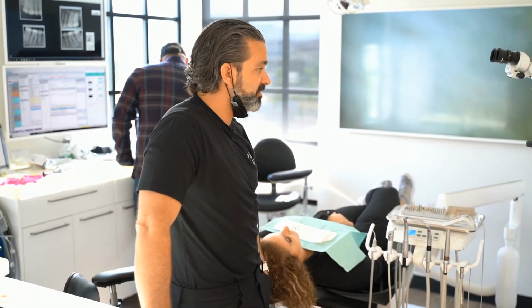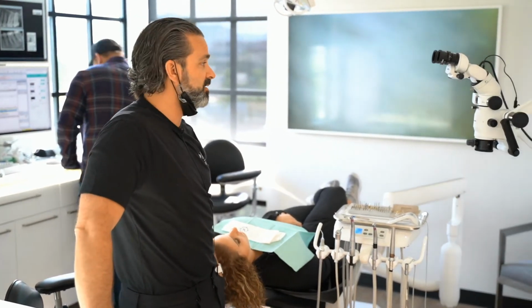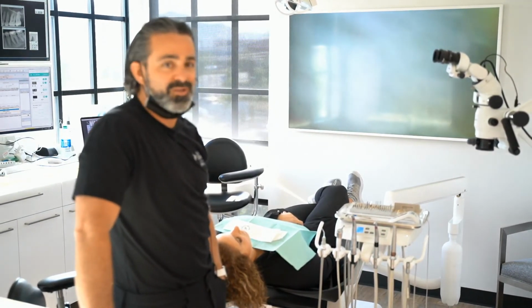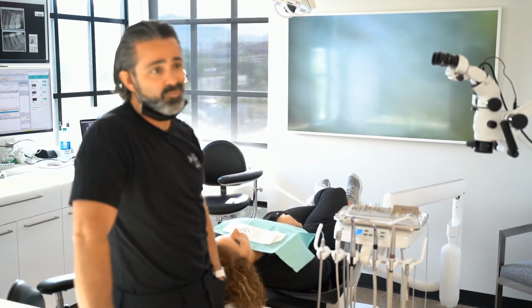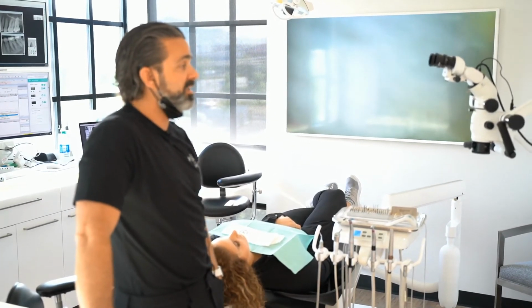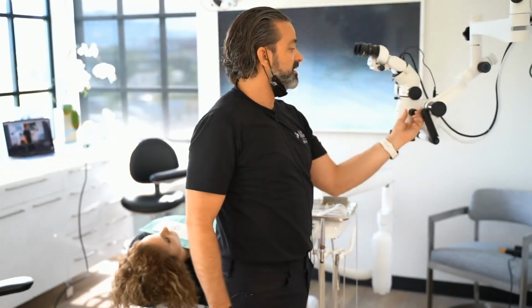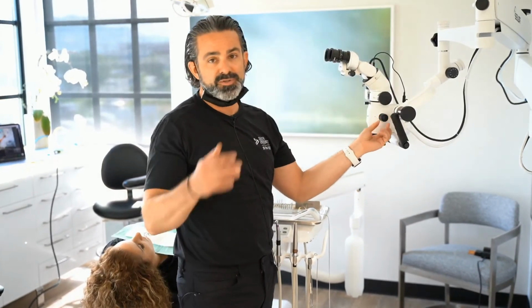Filters, the ability to filter, is a must. You aren't going to want that light on a setting composite. It just shortens your working time. And more than you would think, you don't work at high light power. I work more on a lower power. The more comfortable I get with a microscope, I like the range of the steps. This is a 6-step, which is another way of talking about a microscope. Different companies do different configurations.